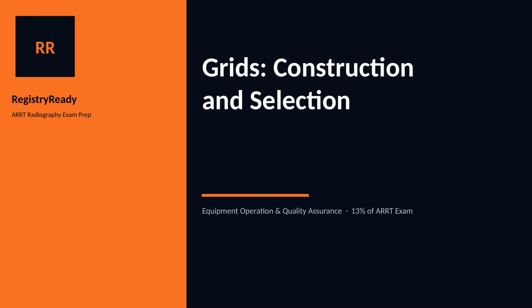Equipment Lesson 8 covers grids, construction and selection. Grids are the primary tool for removing scattered radiation from the image after it has already been produced inside the patient. Understanding how grids are built, how they are characterized, which grid to choose for a given clinical situation, what happens when they are used incorrectly, and how to convert technique when the grid changes, all of this is directly tested on the ARRT and used every day.